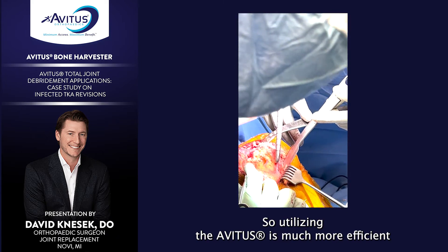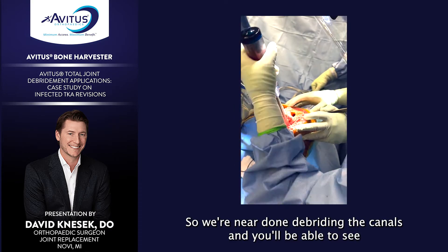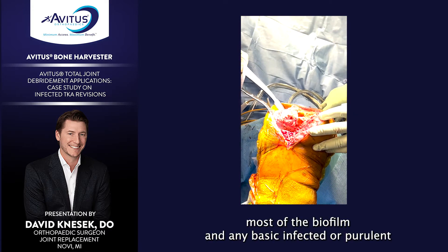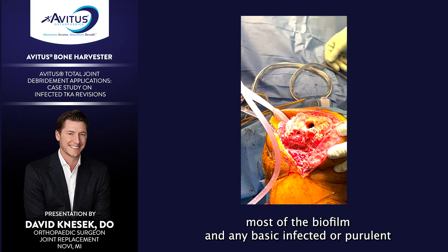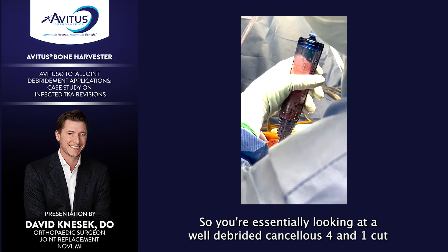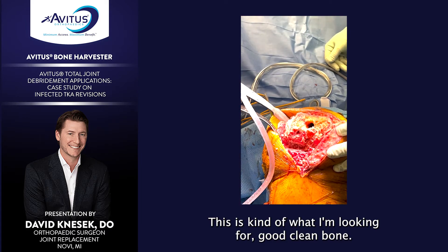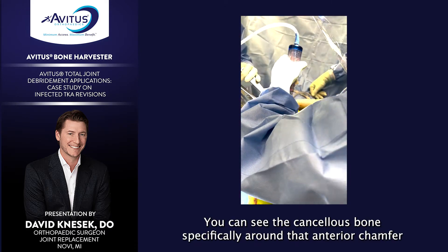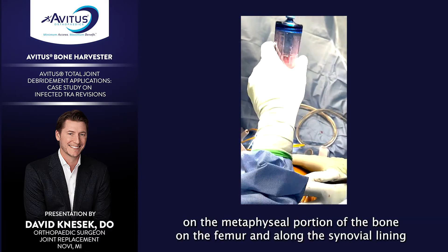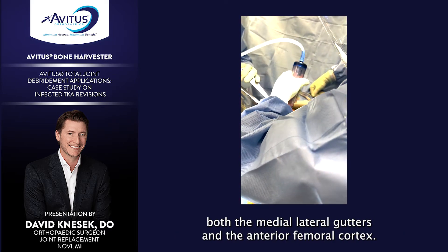Utilizing the Avetis is much more efficient and aggressive in terms of removing this biofilm. We're near done debriding the canals, and you'll be able to see most of the biofilm and any infected or purulent synovial tissue from around the femoral component. You're essentially looking at a well-debrided cancellous 4-in-1-cut femur — good, clean bone. You can see the cancellous bone specifically on that anterior chamfer cut. The majority of any biofilm or membrane is gone on the metaphyseal portion of the femur, along the synovial lining, and in the medial and lateral gutters.